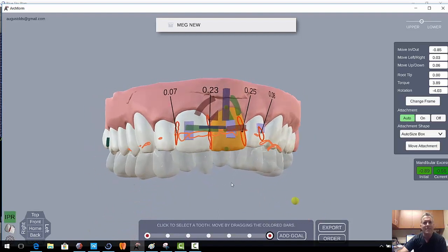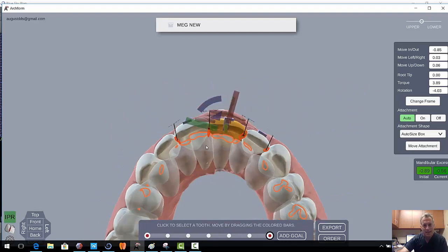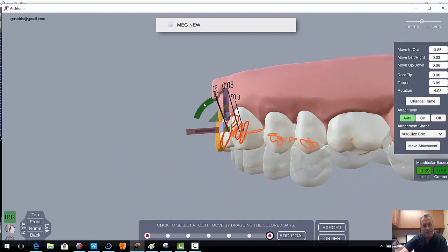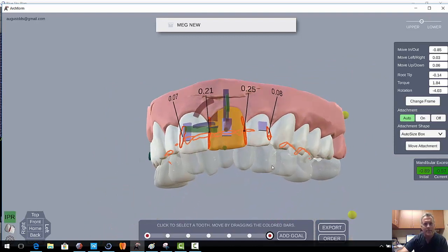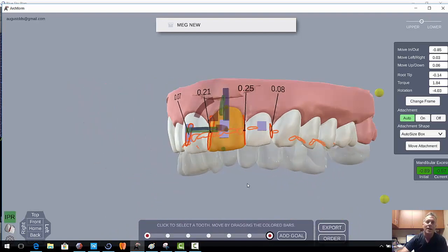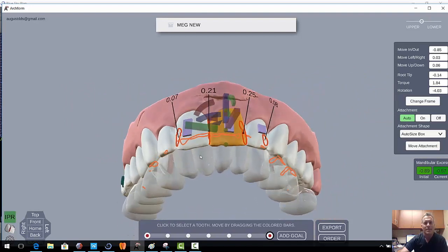Looking at the amount of IPR, we actually have a lot of IPR on either side of these teeth, so we may want to see if we could maybe not bring it in that much and see how it looks. That looks a little bit better. Our IPR is still 0.21, which is not outrageous. That is coming off of 2 teeth, so that's probably going to be okay.